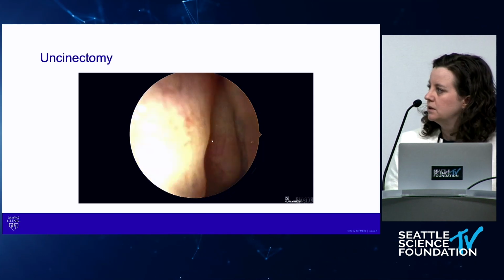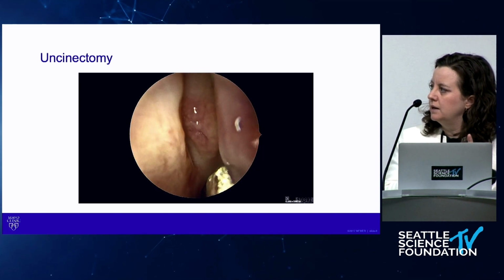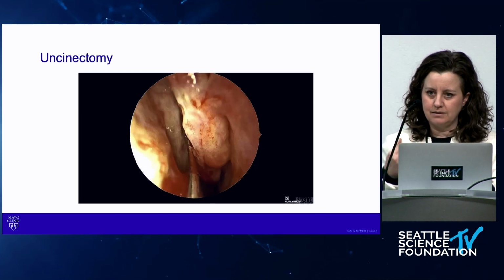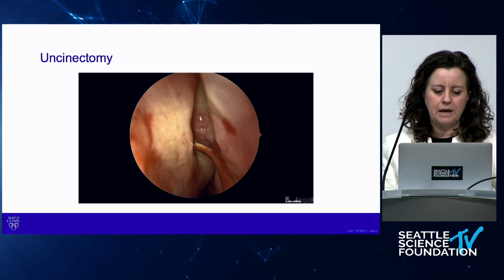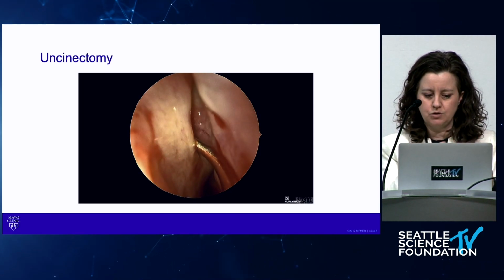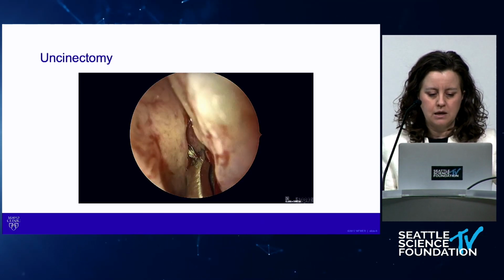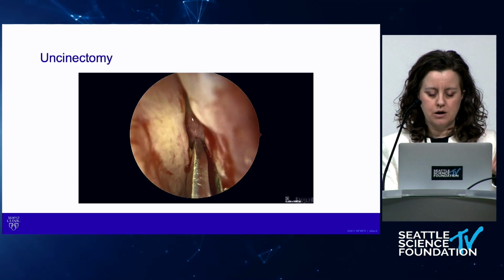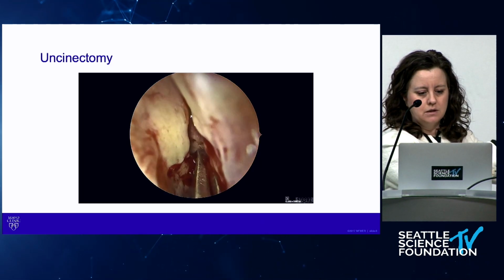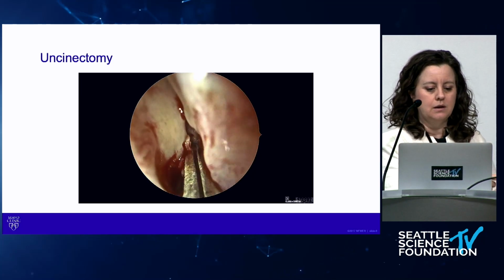Now we're seeing the uncinate and the bulla. I was taught by Don Leopold, my fellowship director, that we want to just gently medialize that uncinate. This is that ball probe. I'm not trying to stick that into the maxillary sinus. I'm just feeling that edge. I'm literally just using the ball. I want to see where it hinges. That's that maxillary line. This is a pediatric Terrier backbiter. So I tell the residents, we're going to cut right here in the corner of our uncinate. We're pulling it away from the lamina, and then we're cutting.